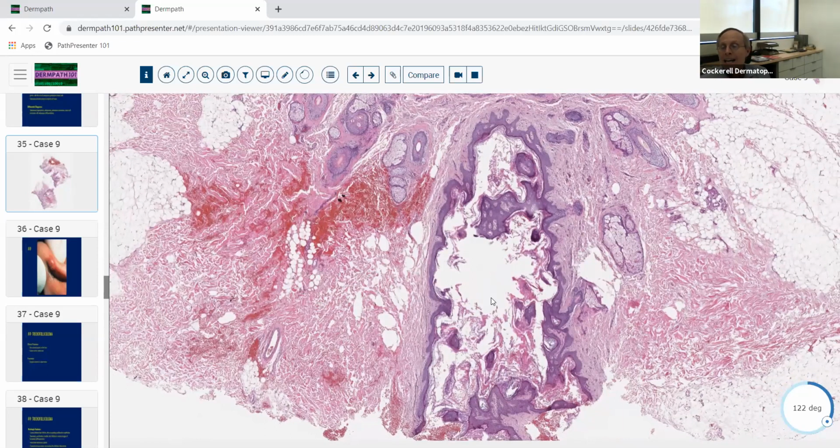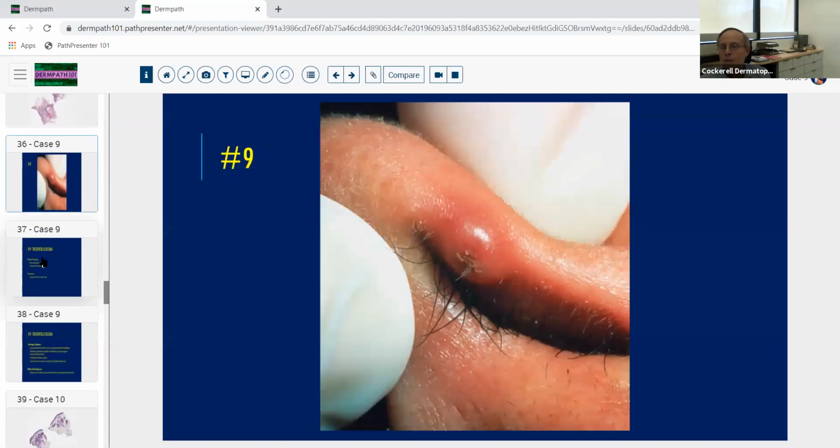So these things, you can think of them as being in a spectrum. They probably really aren't in a spectrum, but you can kind of think of them as a spectrum. That dilated pore of Winer is a cyst. It's just got this sort of reticulated proliferation at the periphery, but it doesn't make the immature follicles, and you get trichofolliculoma that makes the follicles, and then if you get little small cysts that sort of form together, you start thinking of pilar sheath acanthoma. So all of these things are kind of related to one another.